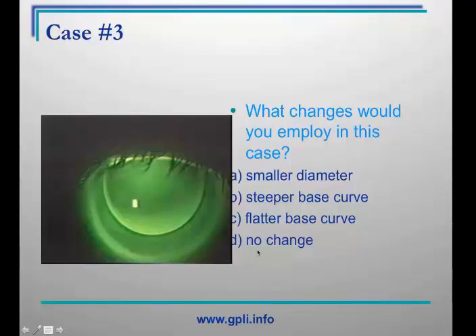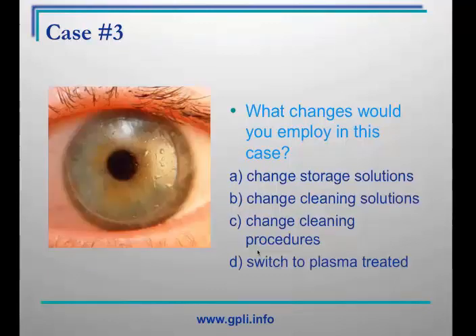Of course, dryness is a great challenge as one reaches presbyopia. Therefore, the problem of poor surface wettability, which you see here, is not uncommon. And really, all four of these approaches could be beneficial. Adding an extra strength cleaner, such as Pro-Gent, the Boston extra strength cleaner, or an isopropyl alcohol-based cleaner, such as Miraflow, may clear up this problem. If the lens is not plasma treated, switching to a new lens that's reordered with plasma treatment may in fact result in better wettability.